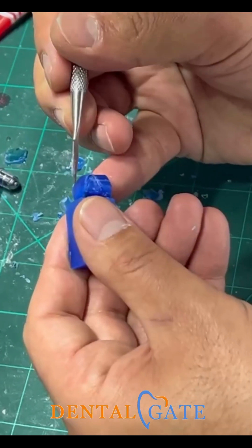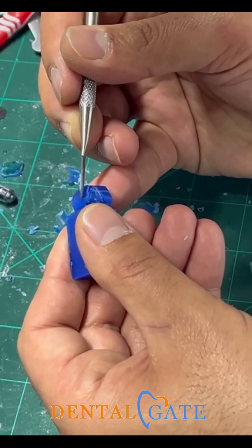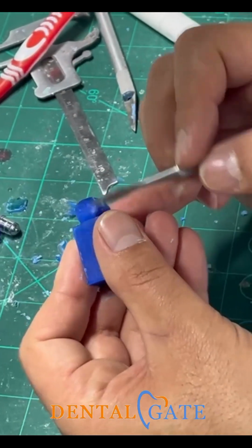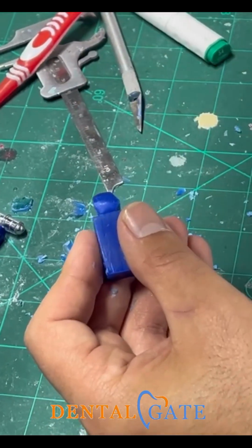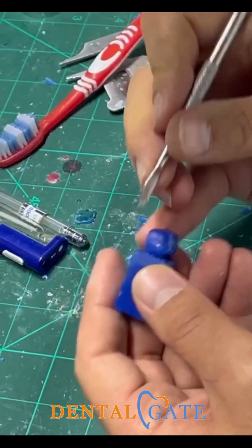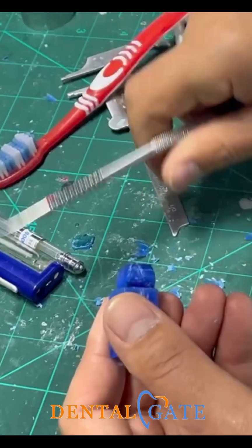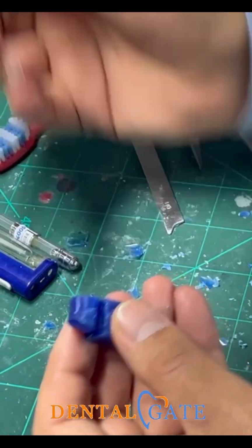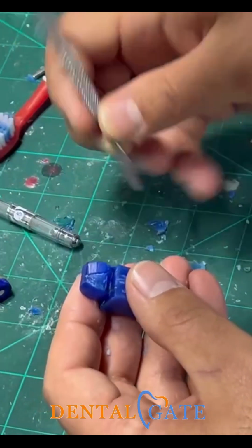So the maximum curvature will still be there. When I make a roundation here, it will be naturally produced. Now what I need is to make the lingual aspect. I had a shape here.